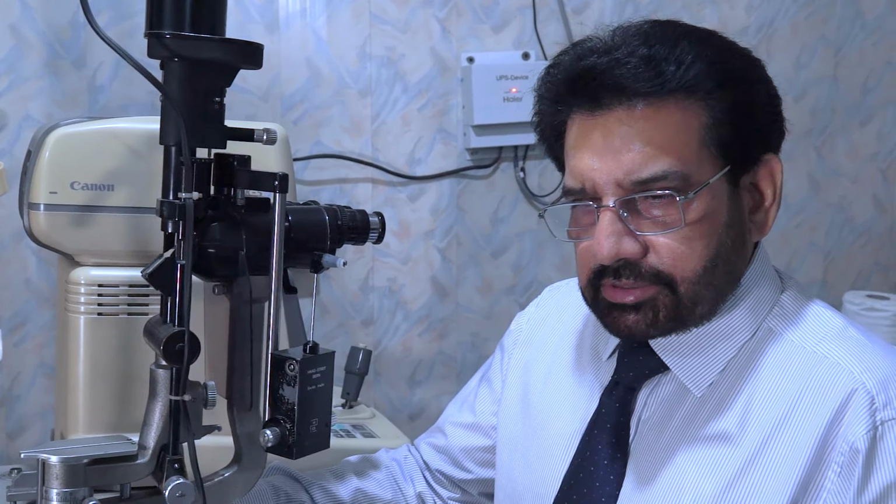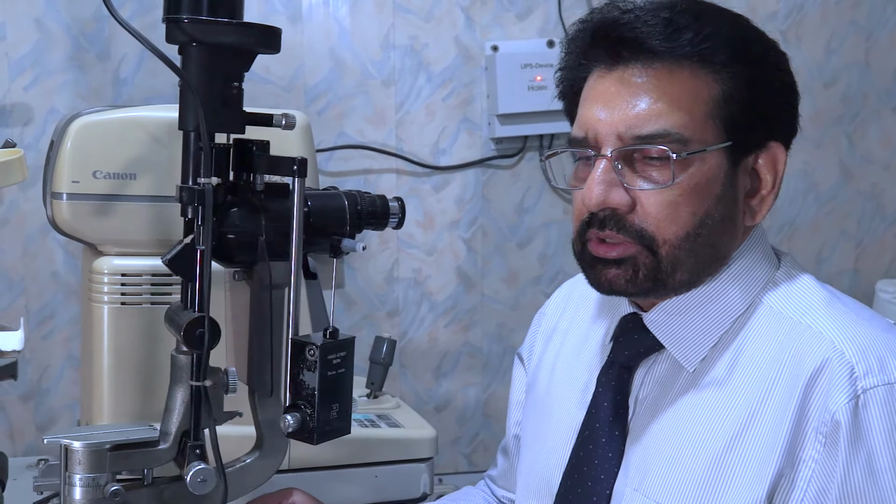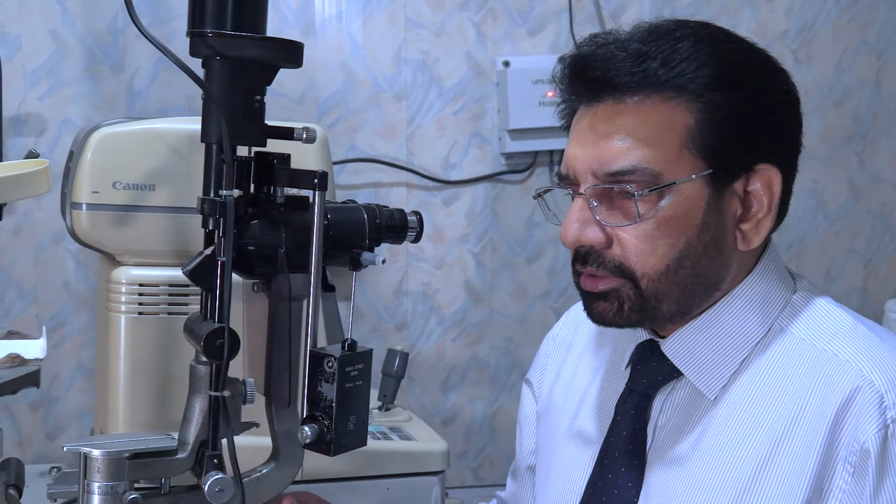This is called slit lamp examination, also called biomicroscopy. This is the most important equipment used in the ophthalmic examination for the diagnosis, and almost 90% of the diagnosis can be made from this examination with this machine.